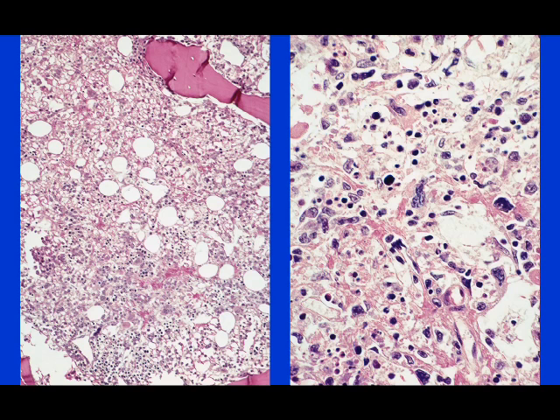I mentioned earlier the bone marrow destruction phenomenon, where you see the stroma of the marrow looking very abnormal, and actually see areas that kind of look like fibrinoid necrosis here. So it's a ratty looking marrow. There's a big histiocyte here on the right side panel with the arrows circling the cell, and we see nucleated red cells in the cytoplasm. Here's a big old histiocyte just filled with these nucleated cells in the cytoplasm.